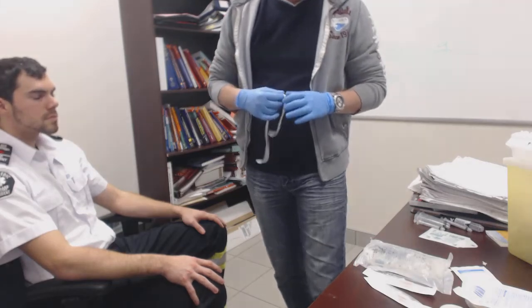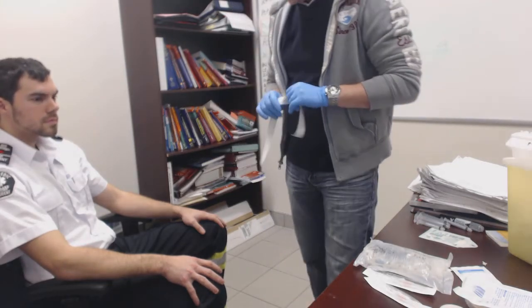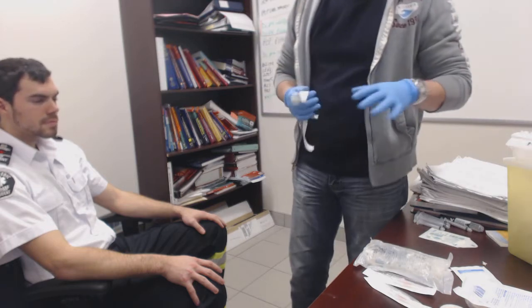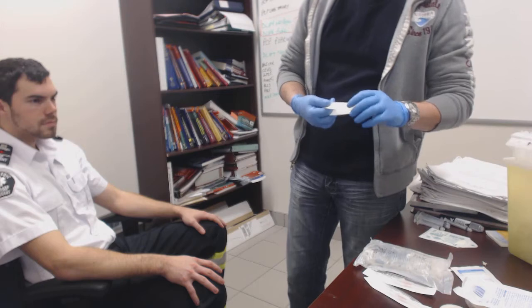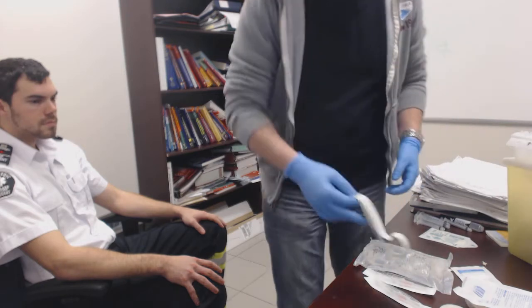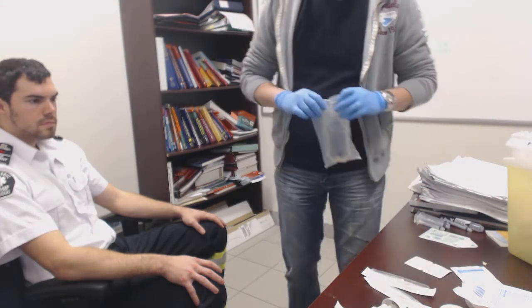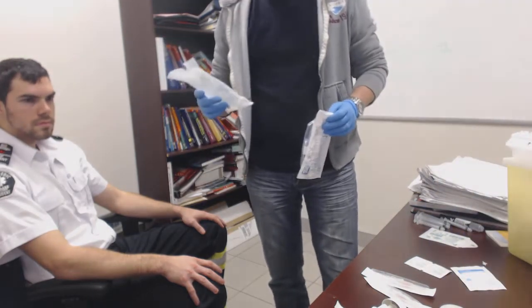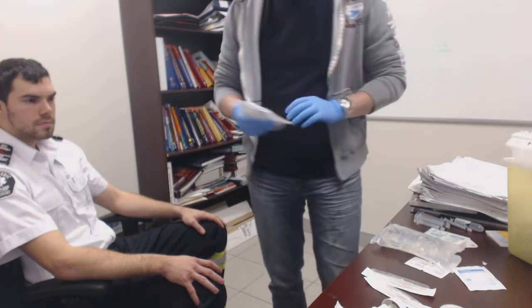Alright, so I'm going to start an IV on Matt here. He's consented to me sticking him with the needle. So before we get into the process of what we're actually going to do, I'm just going to reinforce what we need for equipment. We have our solution, IV solution. This is normal saline, it's still within date.